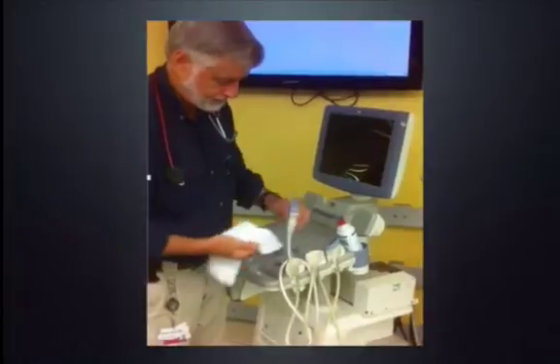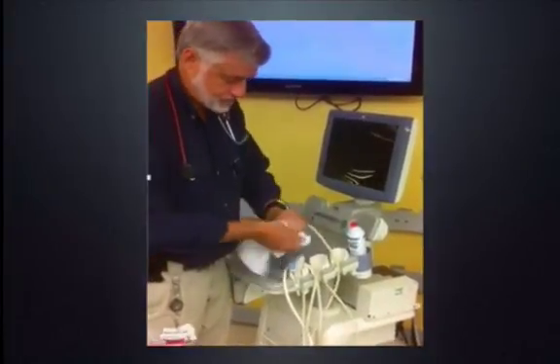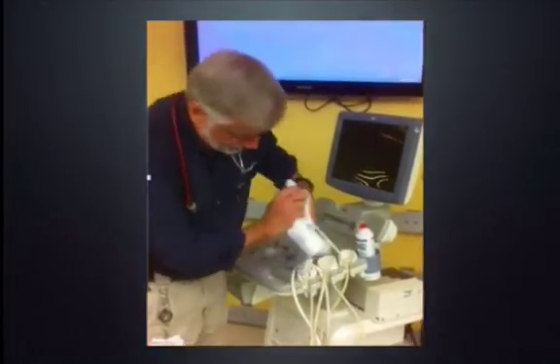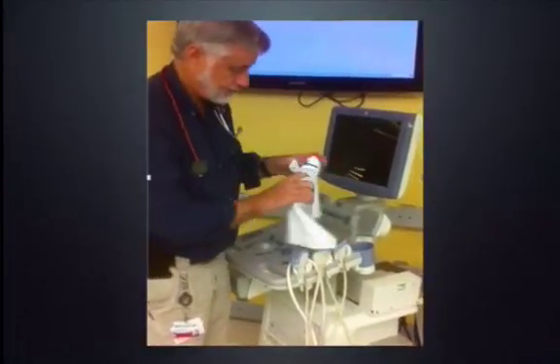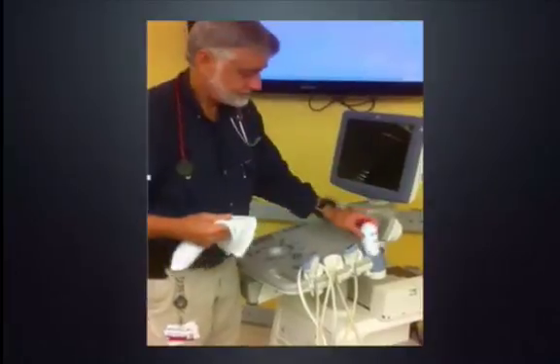I'll also remind you to clean the gel. I don't know of anything else on the ultrasound machine that's probably as dirty as the gel bottle, because everyone puts their hand on the gel after they put their hands on the patient.